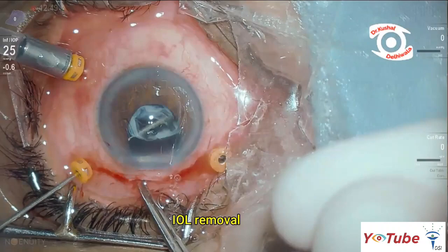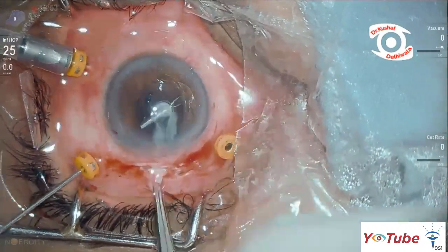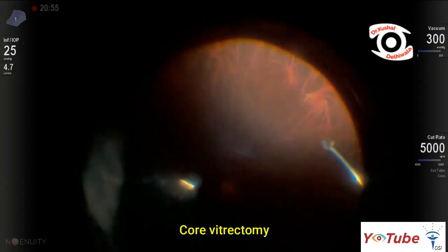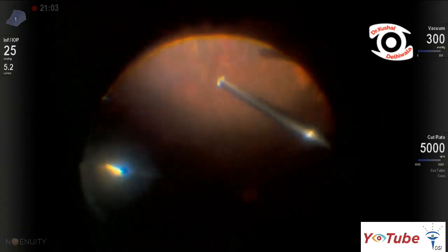Subsequently, the IOL was removed from the tunnel, followed by the capsular bag. This was followed by completion of pars plana vitrectomy. The periphery was assessed with indentation to check for retinal breaks.